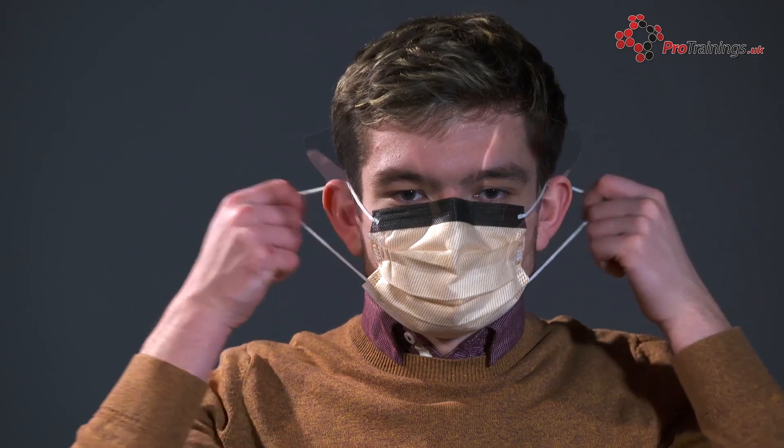If the mask has ear loops, you can use these to remove it from your face. If there are bands, first bring the bottom band over your head and then pull the top band off, removing the mask. Hold the top band while doing this.